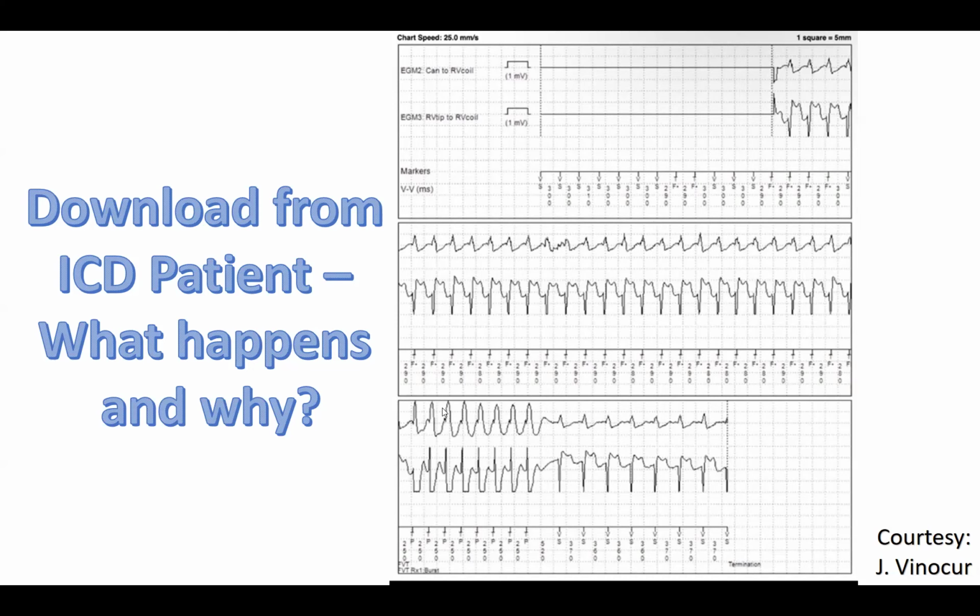So this is an example of anti-tachycardia pacing. Most of the time we leave this feature on. I'll tell you that when defibrillators first had this feature, when I was a fellow, we used to routinely induce VF in everybody in whom we put a defibrillator. It's what we would call defibrillation threshold testing. The patient would have the defibrillator implanted, and before you put your final sutures in, you would instruct the device to put an R on T, or to pace at a very rapid rate and induce VF.